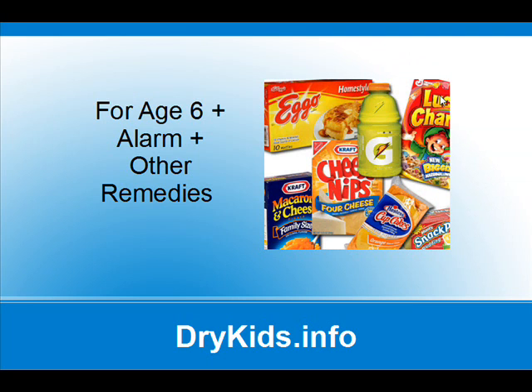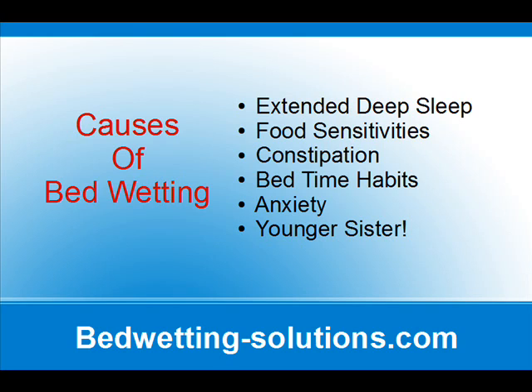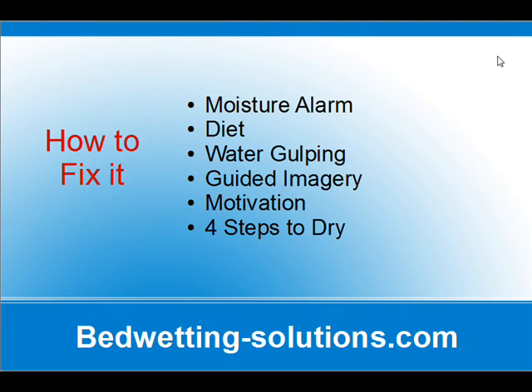The bedwetting alarm treats a deep sleep problem by waking up the parents who wake up the child, and then the child will hear it eventually, and eventually the child will want to get up before the alarm buzzes because the sound is annoying. For this to work, you need persistence, motivation, and for a while, some lifestyle changes. So the right way to use an alarm is not to just give it to the kid. That doesn't work. You have to treat all of the other causes in a shotgun approach to be sure you catch the real cause. Avoid problem foods like dyes and citrus, do proper hydration, guided imagery helps a lot, and eventually the child will go through the different stages of the alarm process, from hearing it to not even needing it.